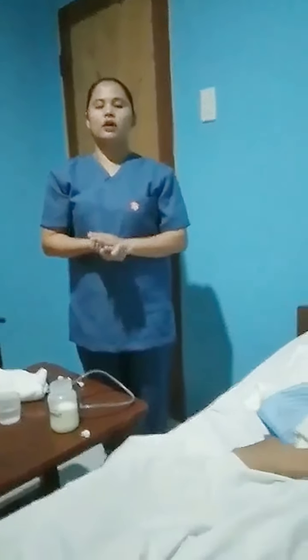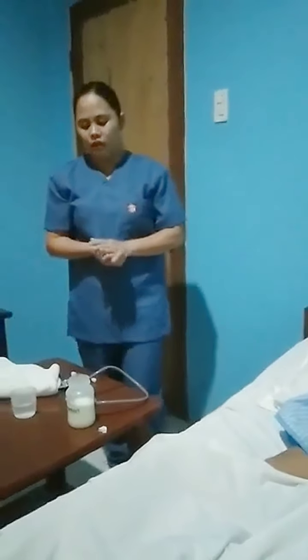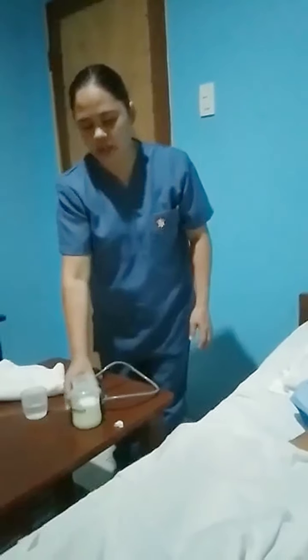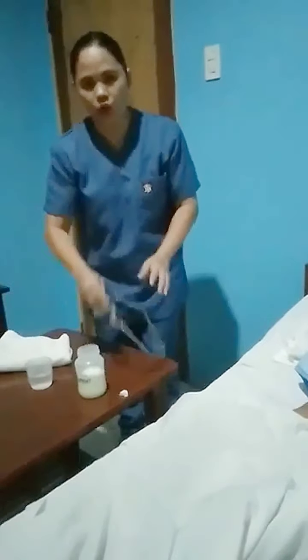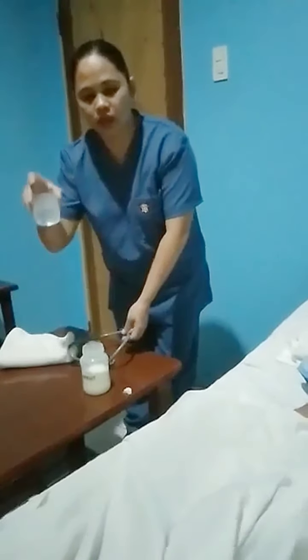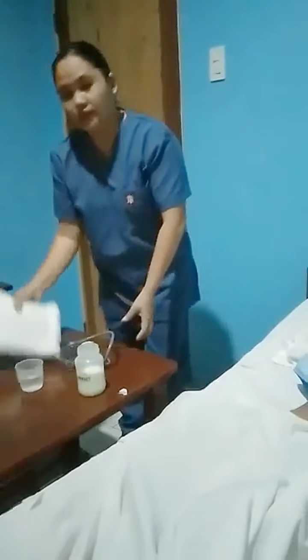And that would be all for the nasogastric tube insertion. Let's now proceed to nasogastric tube feeding. The materials that we need are as follows. We need our feeding formula. Warm is indicated. We have stethoscope and drinking water and towel.